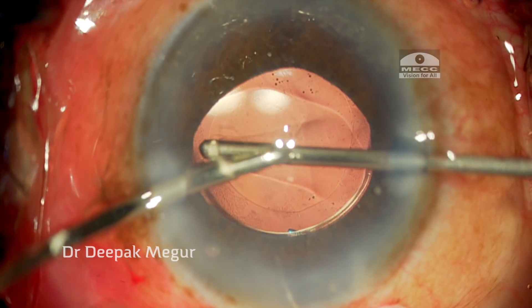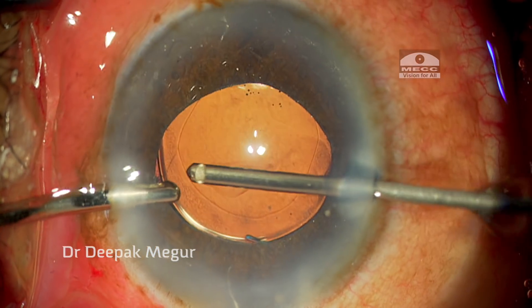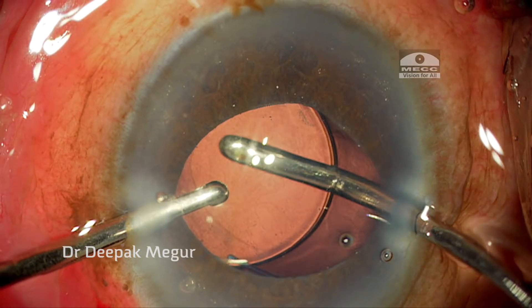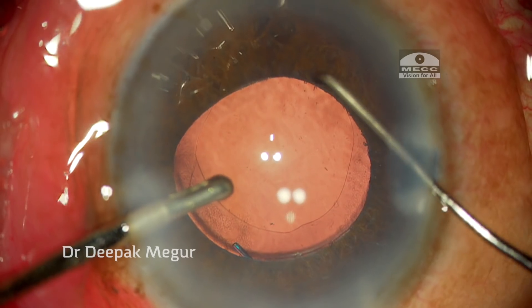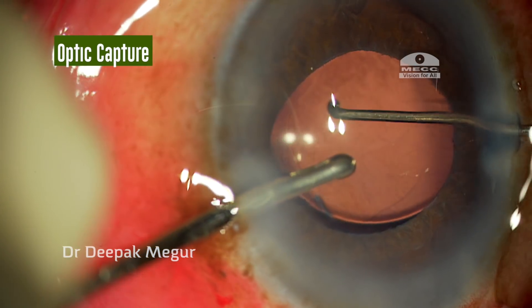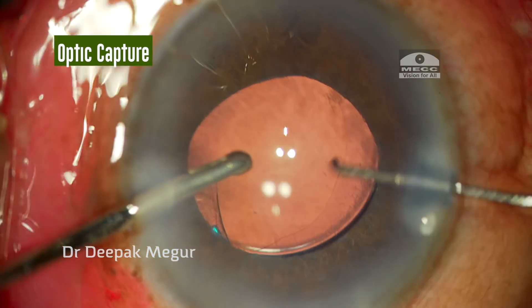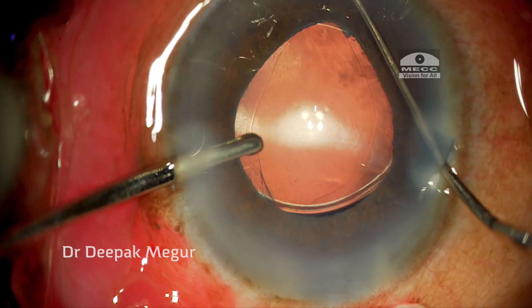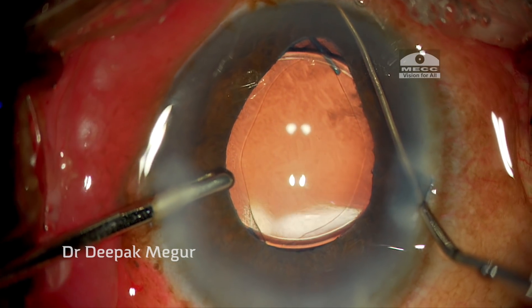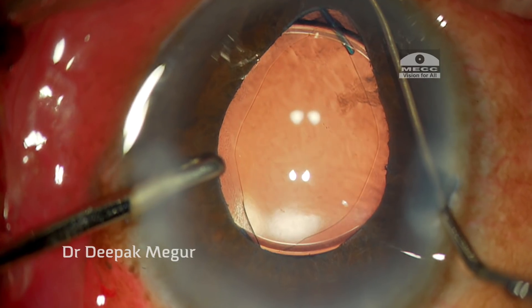Once the vitreous is removed, I take care of the OVD. The OVD in front of and behind the lens is removed — I used sodium hyaluronate, which can be removed quite easily and completely. Once the OVD is removed, it's time to achieve the optic capture. Using an irrigating cannula in my left hand and a Sinski hook, I gently manipulate the optic of the lens into the bag by pushing and nudging it sideways. The successful optic capture is indicated by the ovalization of the capsulorhexis — the haptics are in the sulcus and the optic is in the capsular bag, nicely overlaid by the anterior capsular flaps.